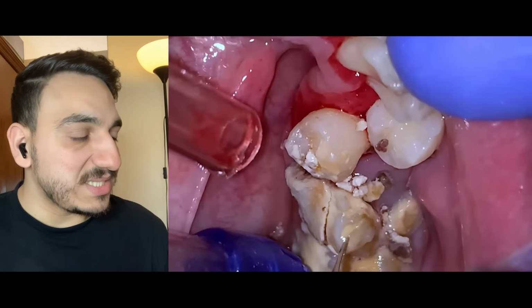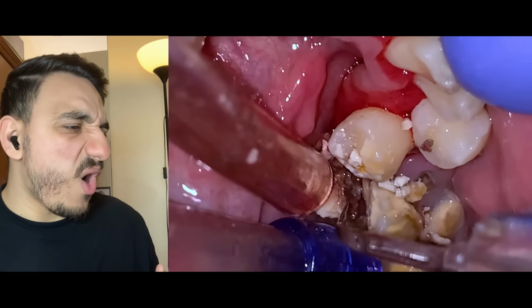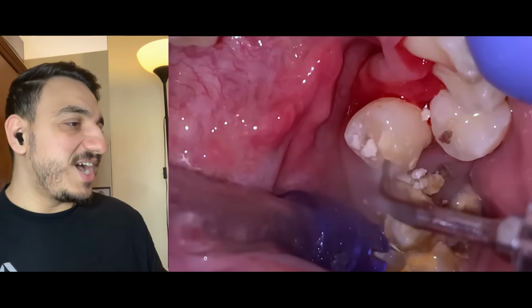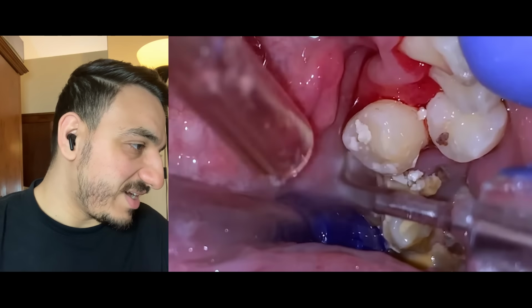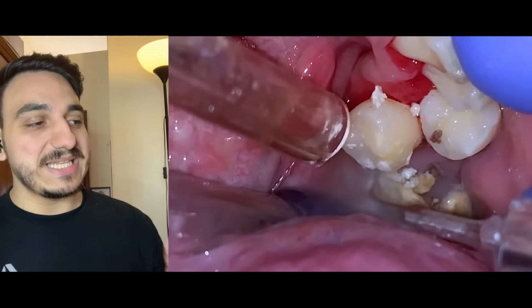Okay, so it looks like some pieces are breaking off also. Oh, look at that huge piece of dental calculus just removed in here. Really some insane stuff. That is a lot of dental calculus, even for a trained eye like mine.